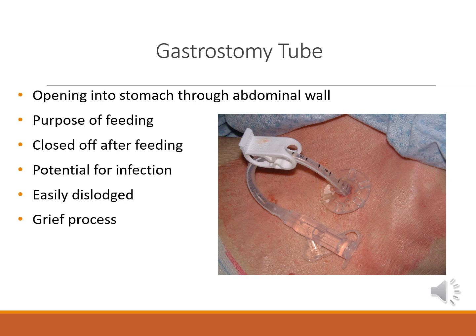After their gastrostomy tube is placed, the patient will have a fresh surgical incision and a dressing in place. For older gastrostomy tubes, a dressing may or may not be used. After the feeding, the tube is closed with a clamp or a plug in an adapter to prevent leakage of stomach contents, and then coiled and secured with tape or a small dressing.